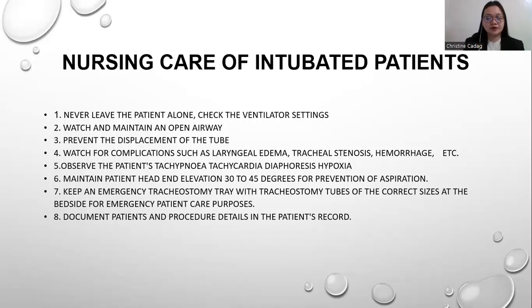And also remember that there should be an intubation set of the same tube size as the patient is using. So if there's any accidental extubation, it is easier for you to call the doctor and insert the ETT immediately.